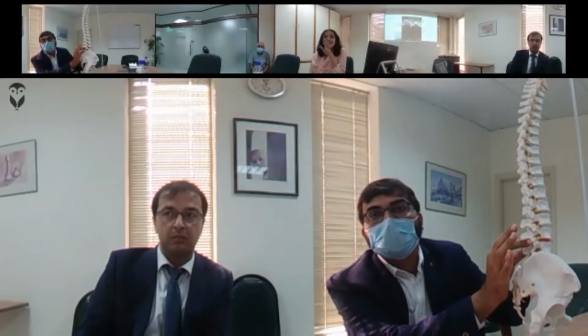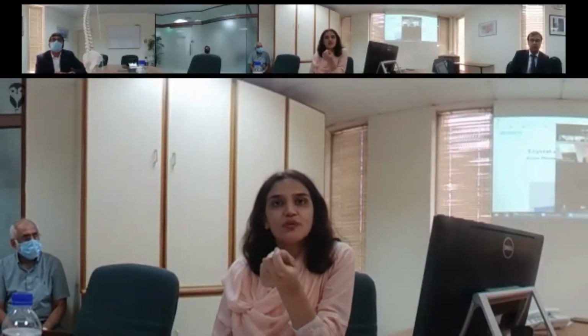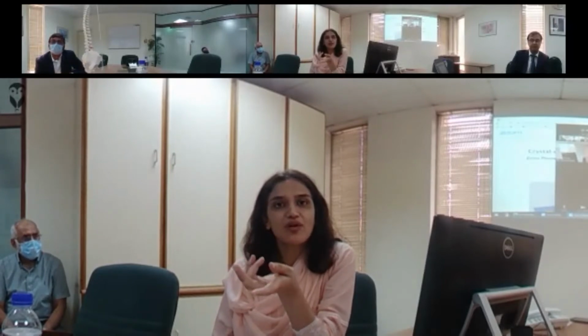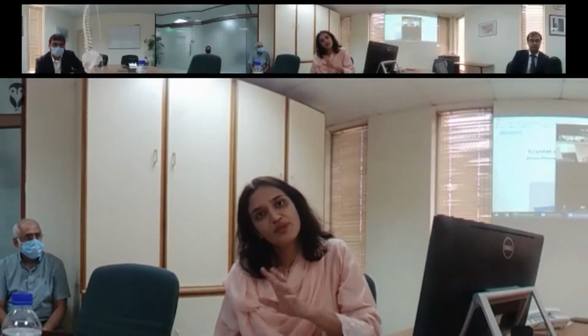Now that is in terms of a disc pathology, where you would be looking at whether it's extraforaminal, foraminal, paracentral or central. So your approach to epidural would change depending on the pathology. And by combining the two together, you're probably covering it from both sides.